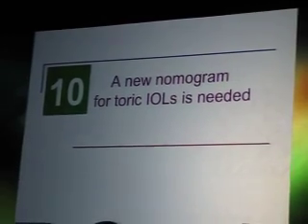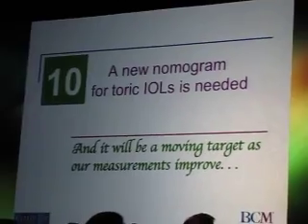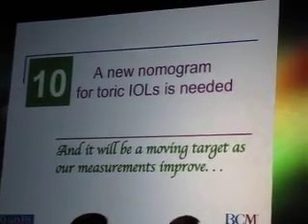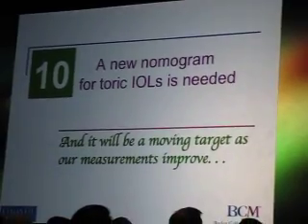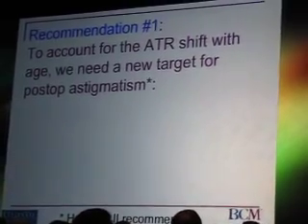So my final point is I think that we need a new nomogram for toric IOLs, and it will be a moving target as our measurements and our understanding improve. I wouldn't by any stretch say that what I'm going to present to you will be the final one that we'll end up with.